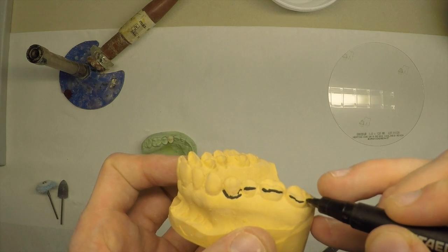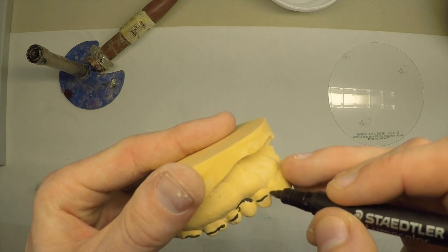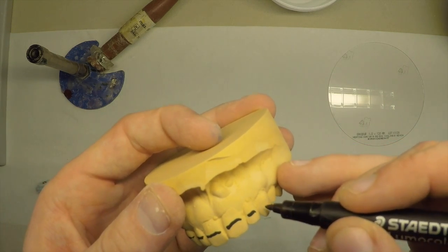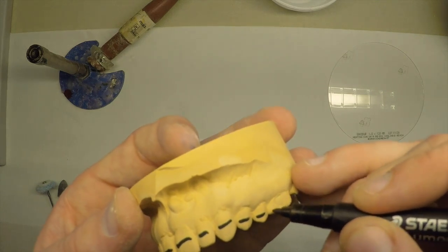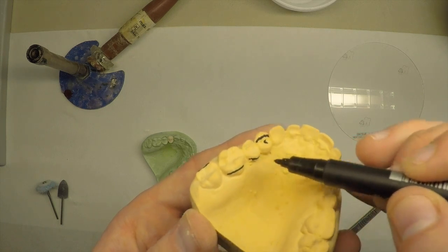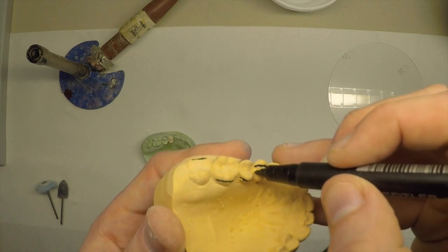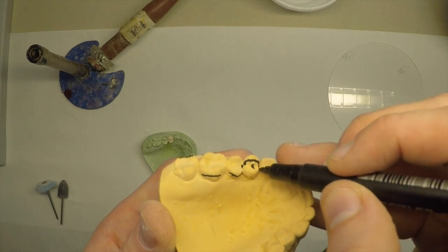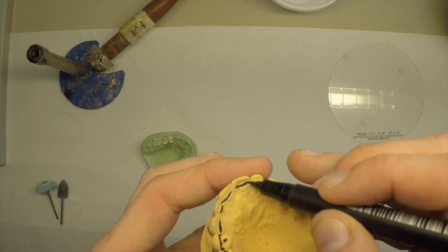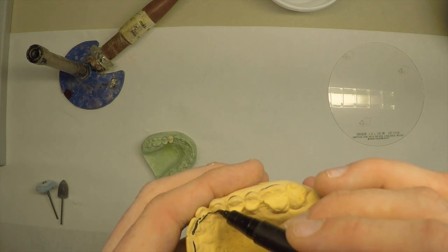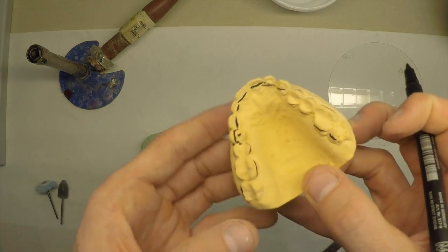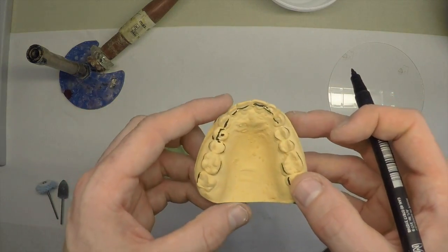We want to do this so that if we do have a large flap, our stent is not going to be in the way of that. When we come under the tooth that we're doing, we're actually going to follow up to that line, just buckle of the access hole. And now we're ready to make the pull down.